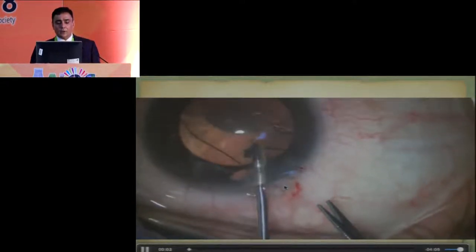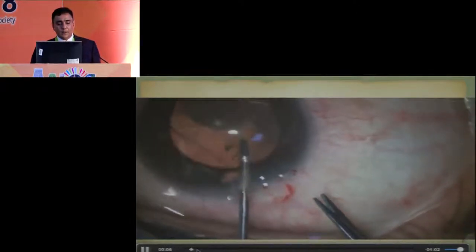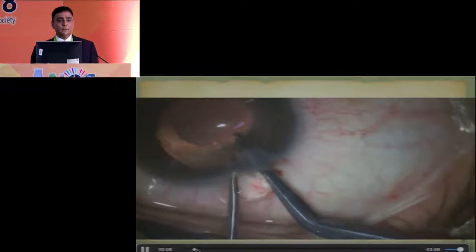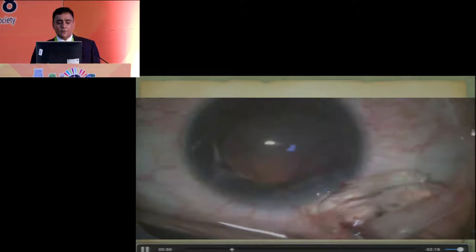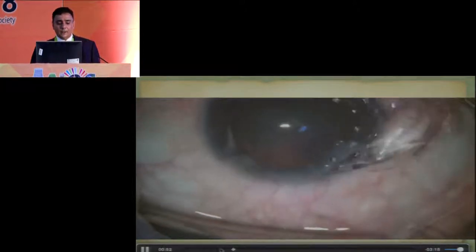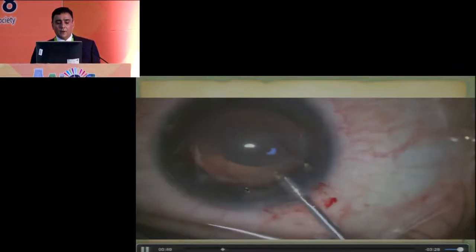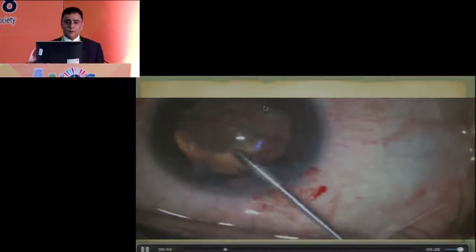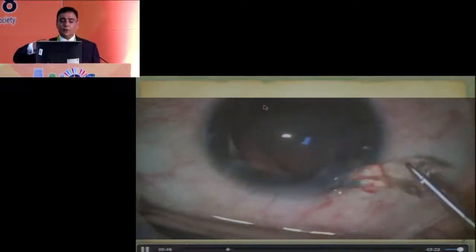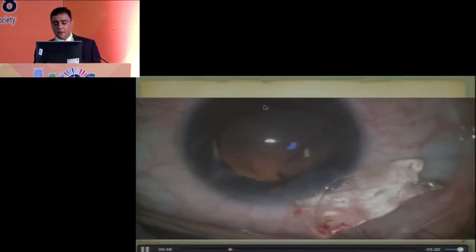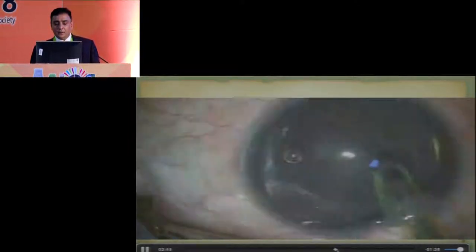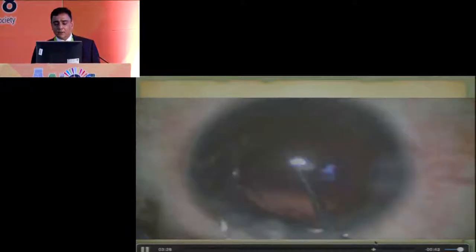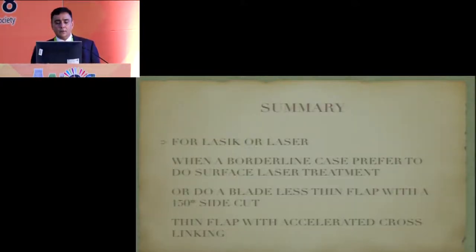Here is another method of ICL removal — a small incision with micro-grasping forceps. Indian ICLs made by Aiocare are almost 250 microns thick, so they are not easy to remove. Cut the ICL in the anterior chamber, bring one half out, and go to the center — you don't need to cut through to the other end. Just go ahead, bring it through the center, rotate it out, and bring the whole ICL out. Then proceed with phacoemulsification, capsulorhexis, and place the lens implant.